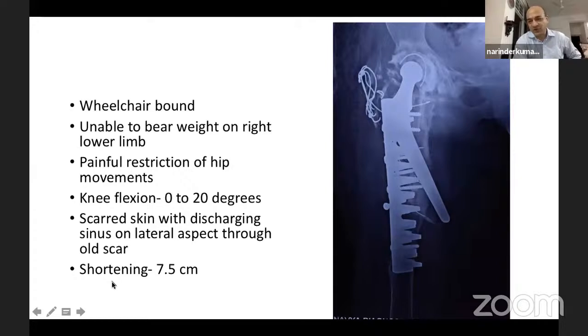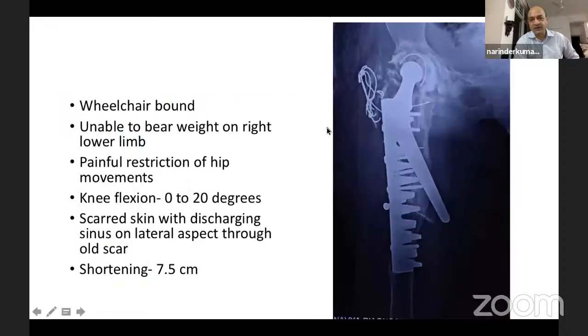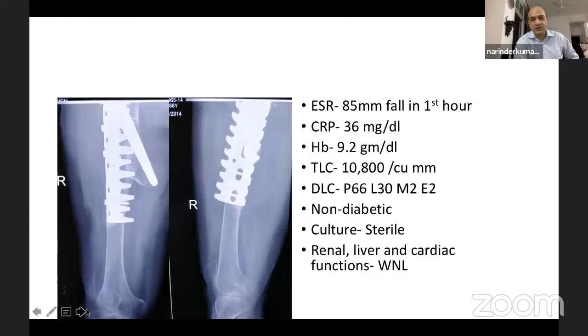And I found the shortening to be about 7.5 centimeter. I'm sure nobody is going to attempt a single stage here. So this is what it looked like distally. Proximally, you can see. And distally, the bone quality was really pathetic. She was a non-diabetic. ESR and CRP, of course, were raised. But culture, as it happens in our country, usually sterile. Rest, most of the parameters were normal.